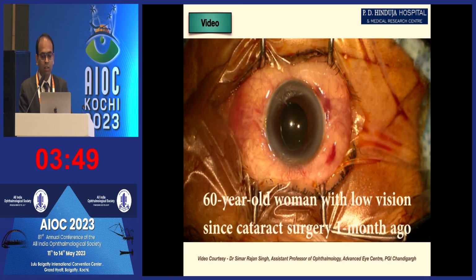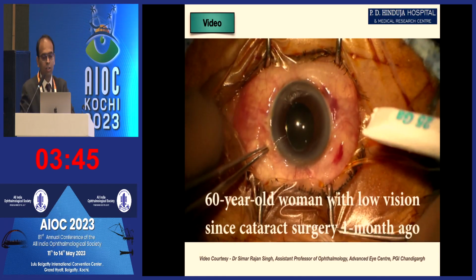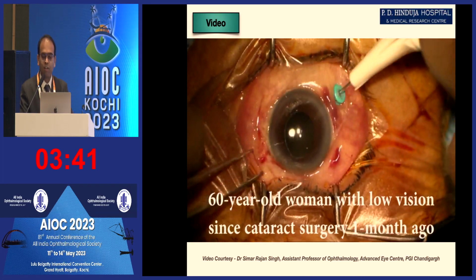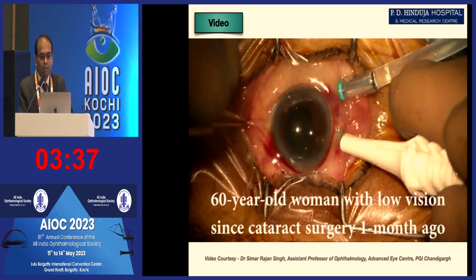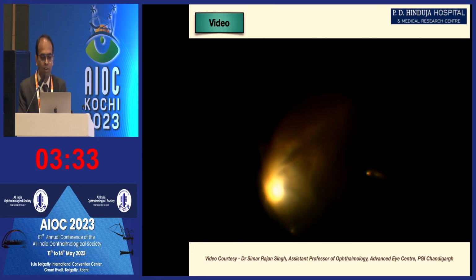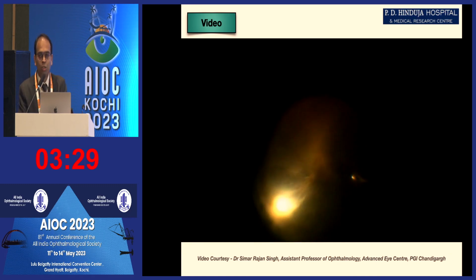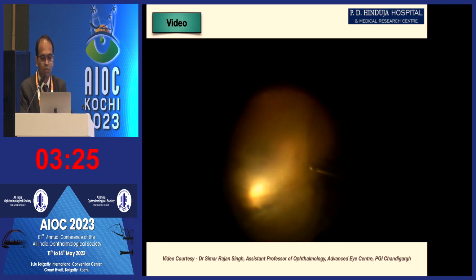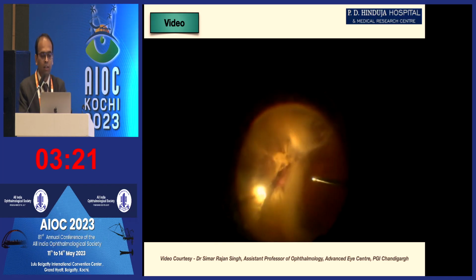This is a video courtesy Dr. Simmer. My video didn't get recorded. This is a 60-year-old woman with low vision since cataract surgery, about a month post the cataract. This was a 25 gauge pars plana vitrectomy, and you can see that the vitreous hemorrhage has almost turned gray now. And as we go through the surgery, do the core vitrectomy, clear the media.